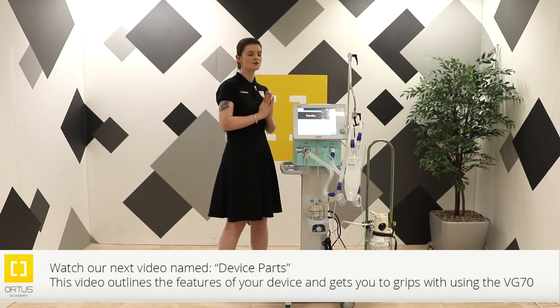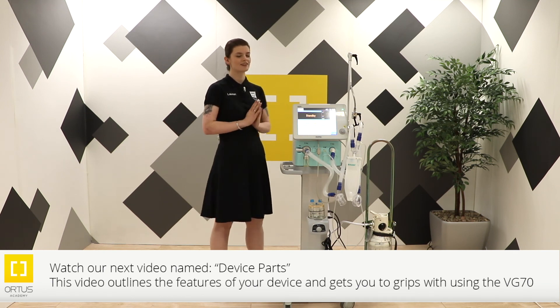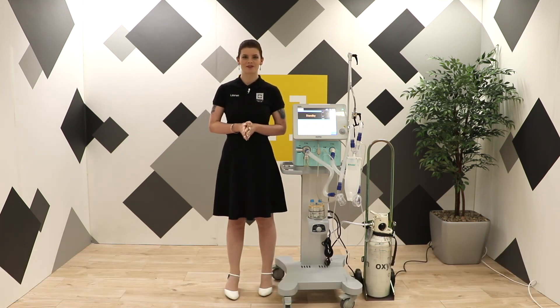Okay, we're now ready to go through the device parts and get you to grips with using your device.